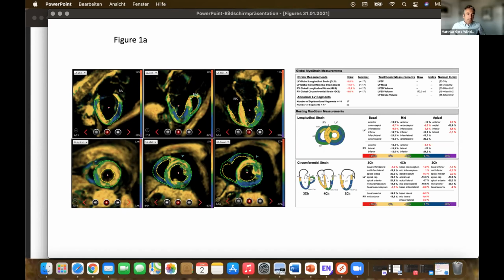Okay. So then last quick question. You need a separate sequence for that, right? That has to run on the scanner. Yes. Okay. But the acquisition that you showed is, let's say, an impressively short protocol in general. So it was basically 15 minutes that you had to spend in the scanner at all without any intervention. So that's why I think this really is a very interesting option.